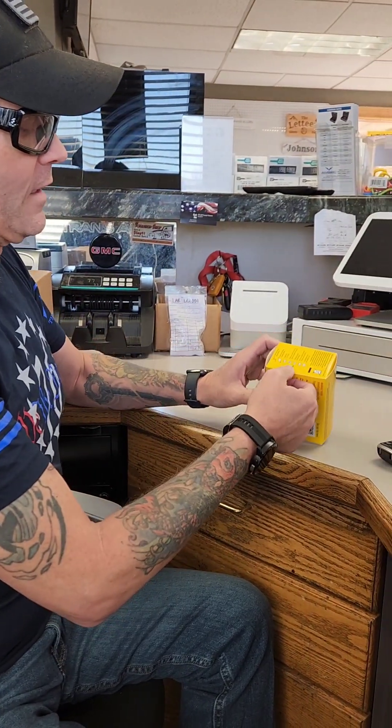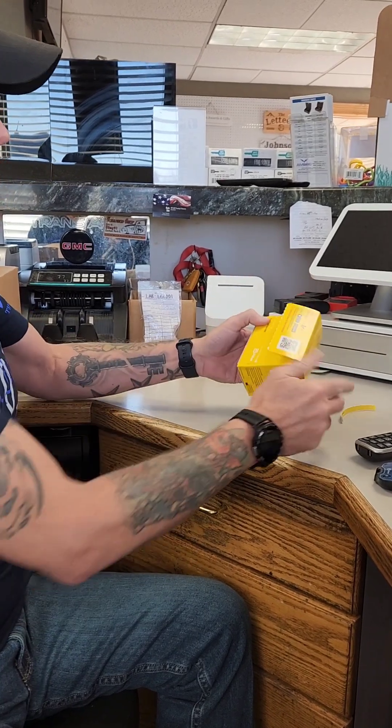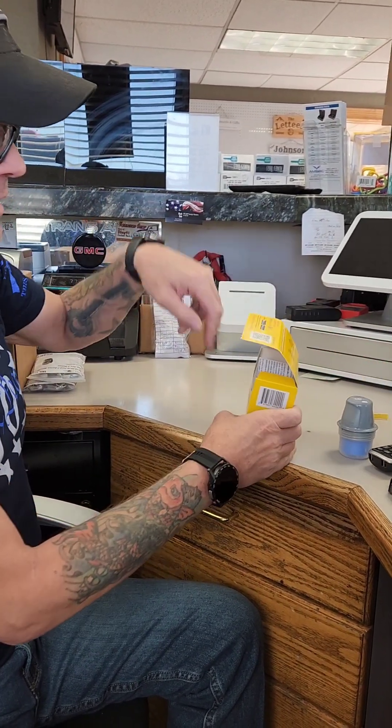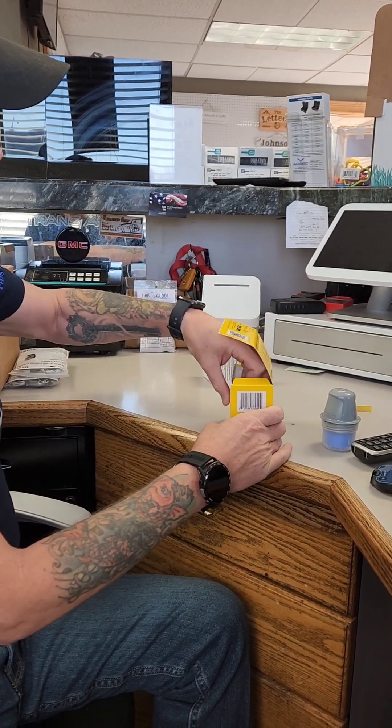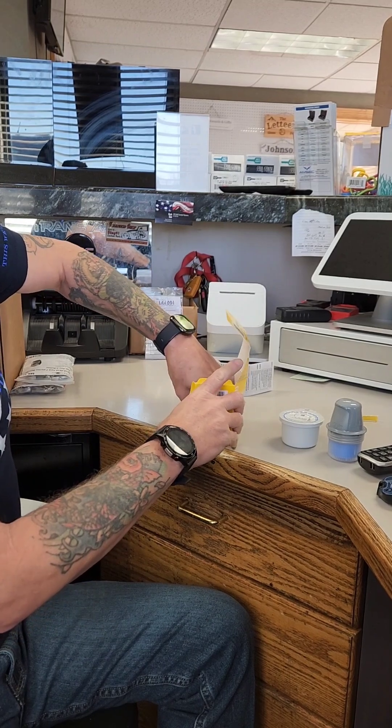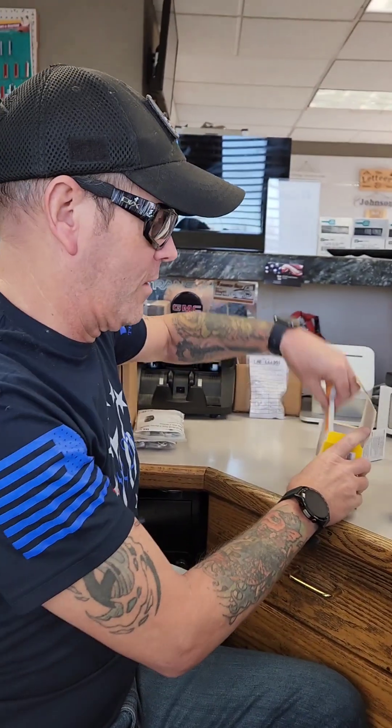Inside the package here — and a lot of people keep asking me where I'm getting these for $35 — I get these from Walmart for $35 and I'm using a GoodRx card that I downloaded from the internet for free.